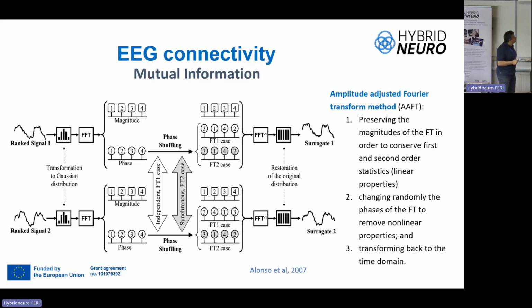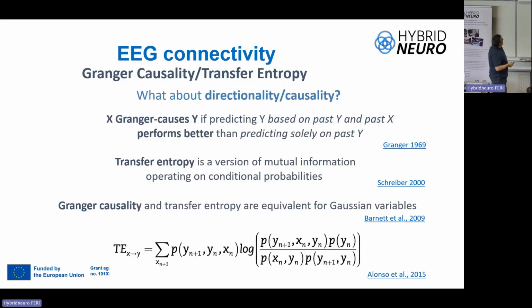So using the ST2, we can evaluate the brain connectivity by mutual information from non-linearities. And here, with the ST1, we have both linear and non-linear. I will show some examples using this later.